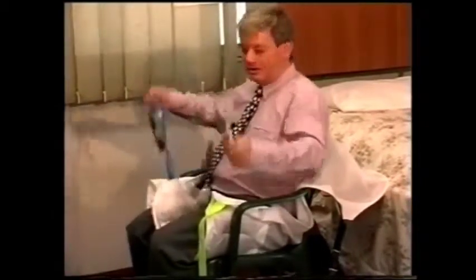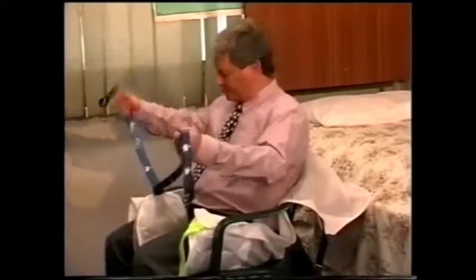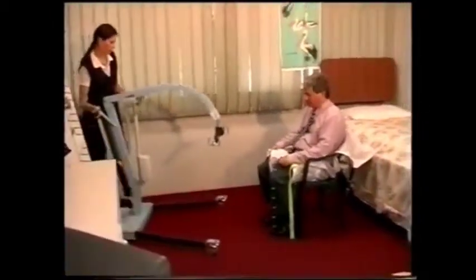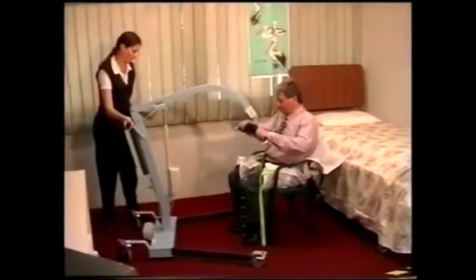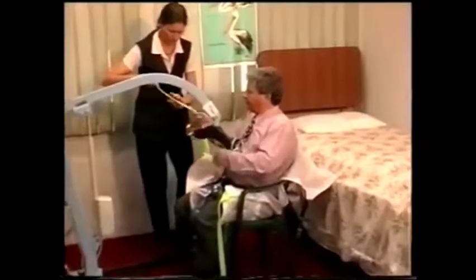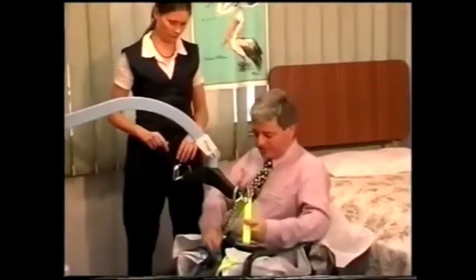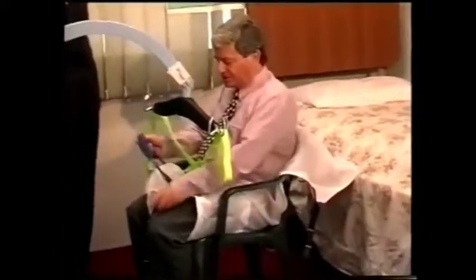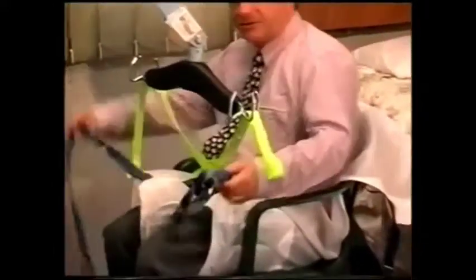The quick way is to just cross it over like that. That might cause a bit of pressure down here on the legs. So it's a nice thing just to loop it through, and then they're held nicely. Another way of doing it, if you can bring the hoist in now. Alrighty, I've got a loop. We could cross over these green ones. Now that holds the hips in, and the leg sections could just go straight up to the same side.